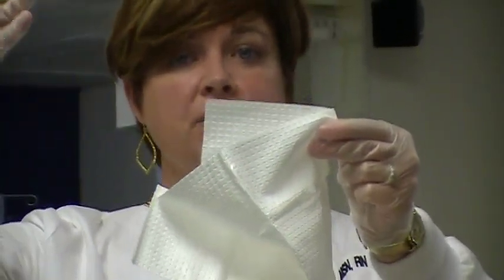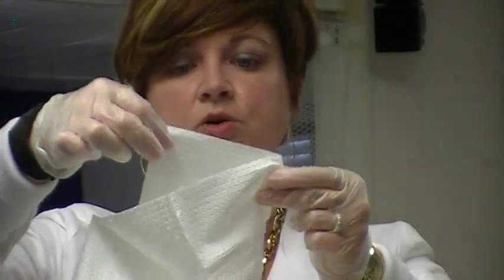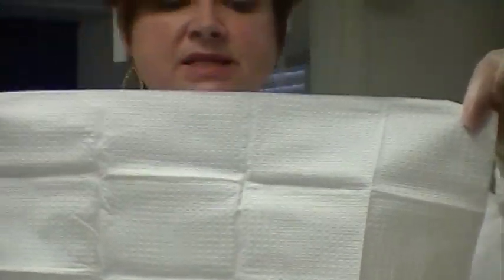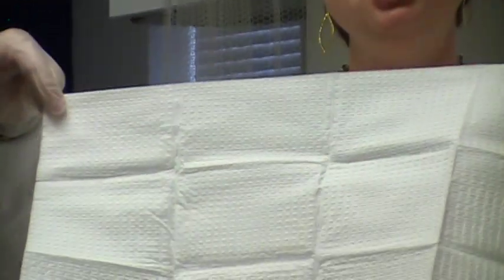And again, hold it up and away so that it's not touching your table. Grasp the sides, then gently let the far side fall, and then let the near side fall. Be careful trying to place it on your table, because when you try to place it, you may come in contact with the table itself with your sterile gloves, and then they would become contaminated.